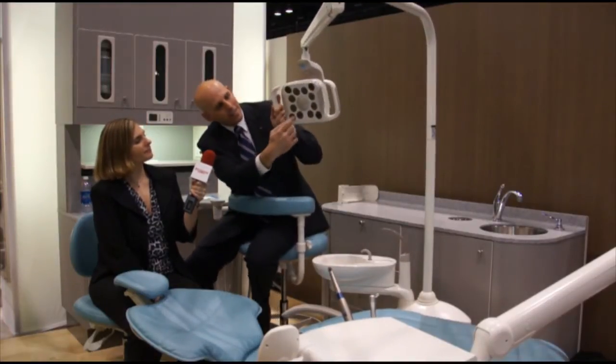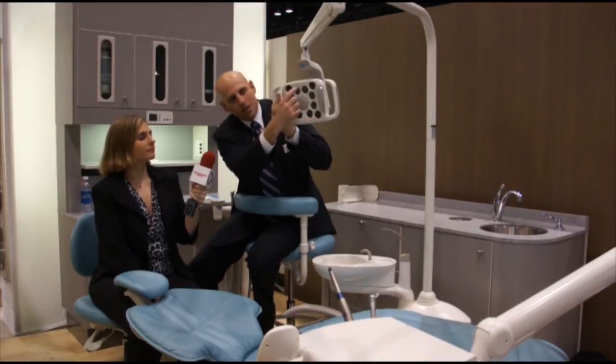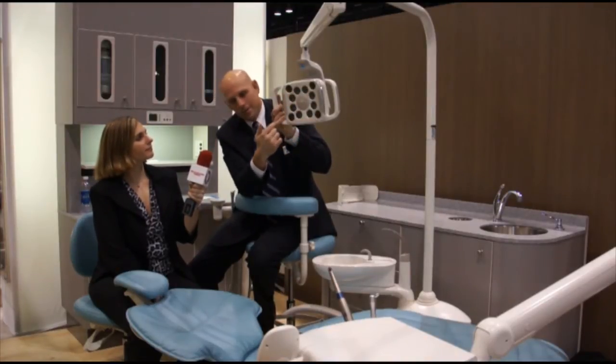Basically, the light is an array of eight white lights, and then we have, in the corners, four yellow light cells.